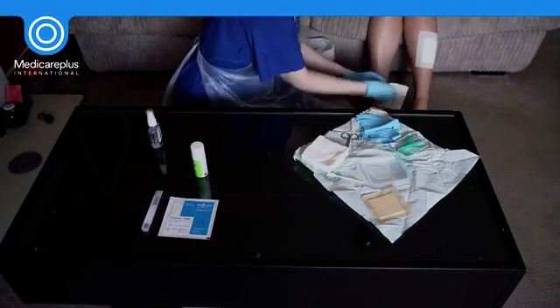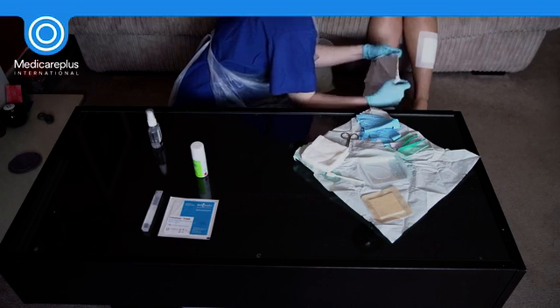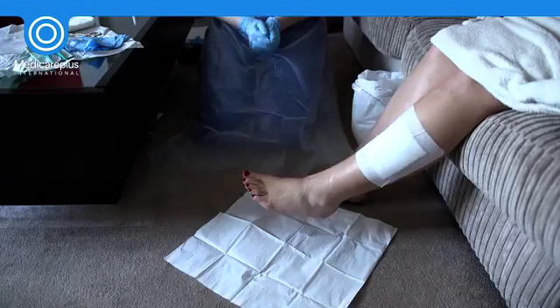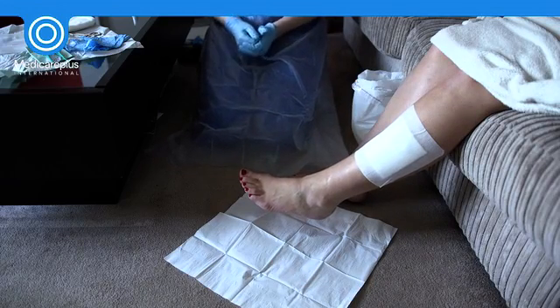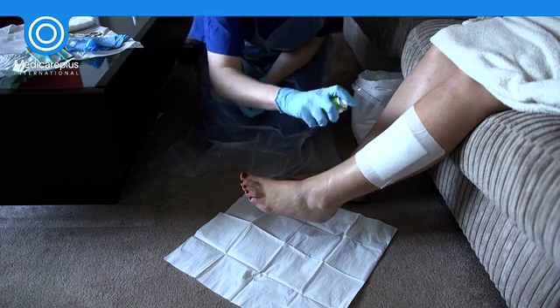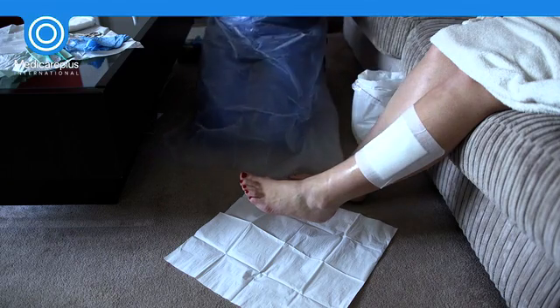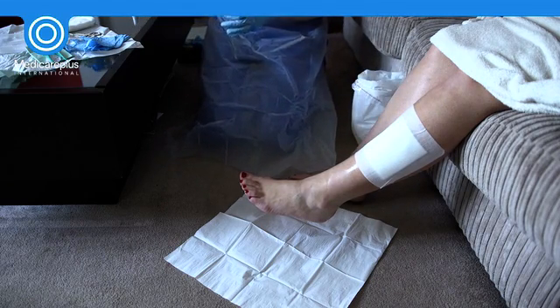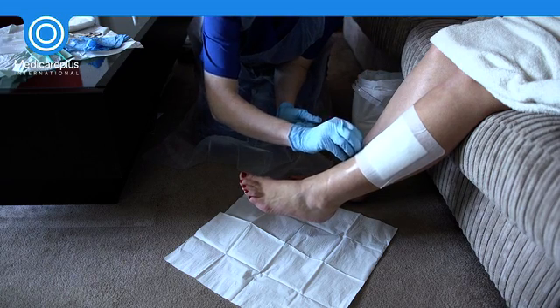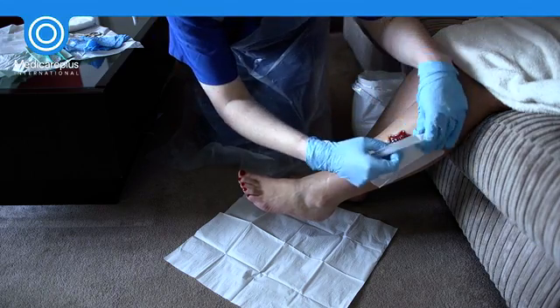Place the dressing towel underneath the wound or limb. Be aware that during this process, a large amount of microorganisms are shed into the air. Dispose of soiled dressings into a clinical waste bag as per your local trust waste policy.